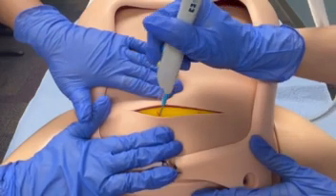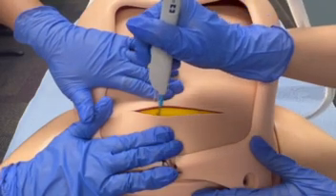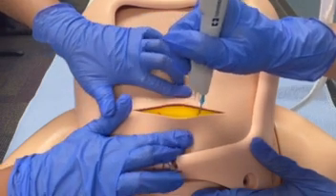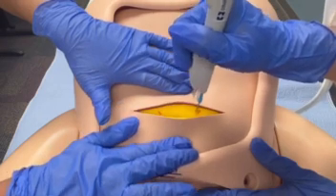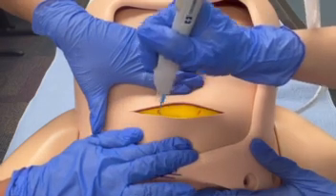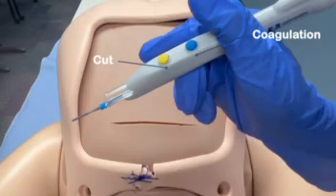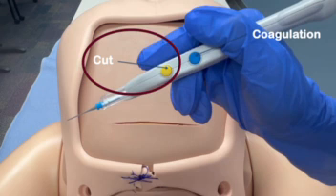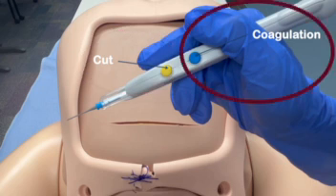Sharp dissection is then carried out through the subcutaneous layer using either the scalpel or monopolar electrosurgery, also called the Bovie, which uses high-frequency electrical current to cut tissue or achieve hemostasis during surgery. There are two functions of monopolar electrosurgery. The cut function, which is the yellow button, is used for precise tissue dissection with less char formation by a continuous flow of current through tissue. In contrast, the coagulation or coag function, which is the blue button, delivers an interrupted, pulsed electrical current that cauterizes tissue and seals blood vessels to control bleeding during surgery.